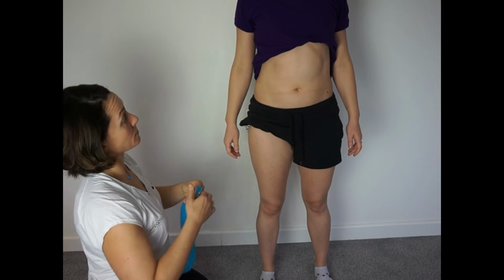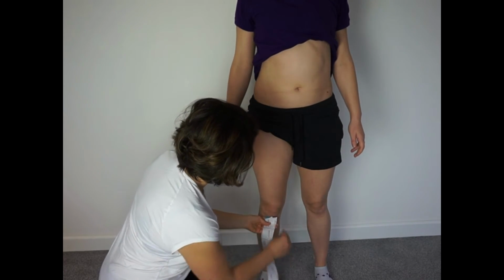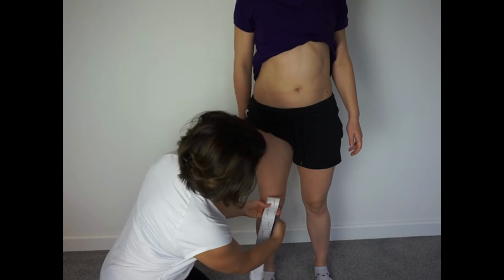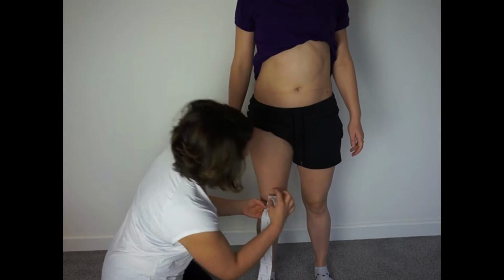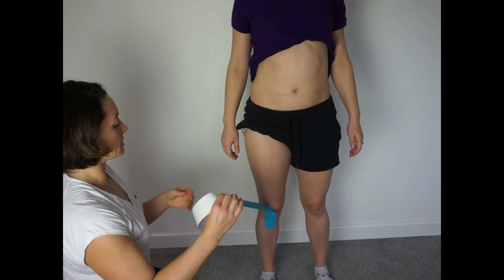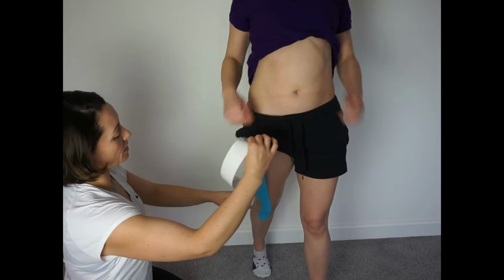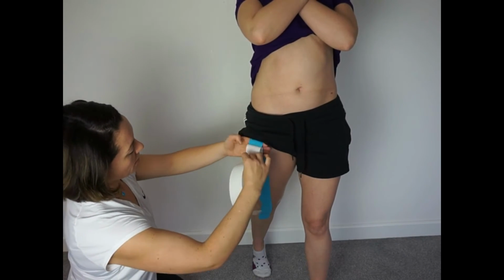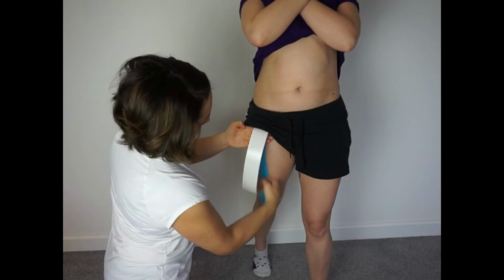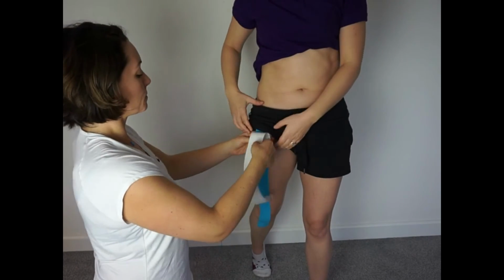So we peel back those first 2 inches and we're going to add them with no tension on the tape, no stretch on the tissue below the knee. Now peel back the middle of the tissue, and it's important if this is at the hip flexor, so at the top of the hip, that we cross the hip with our taping. So get your client into hip extension, light stretch on the tape, and we're going to anchor it right down and across that AIIS on the front of the pelvis.